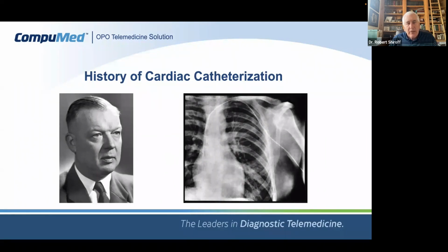He, over a few drinks, said that he was doing a left heart cath, and at that time they put in a catheter that had end holes and a side hole. Now, a catheter is a plastic tube that is hollowed out, and it had an end hole, at the end of the catheter, so you could measure pressures, and side holes, so if you inject a dye, it wouldn't come out as a jet. It would come out of all the three or four holes that were there. We were doing this for several years, from the 40s on.